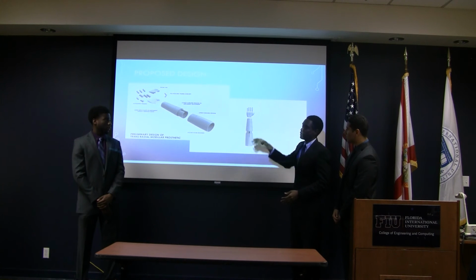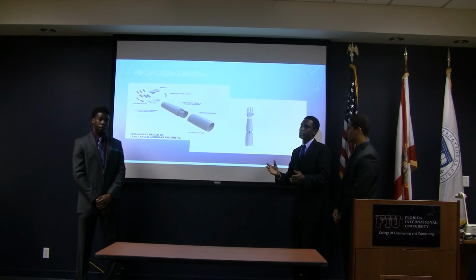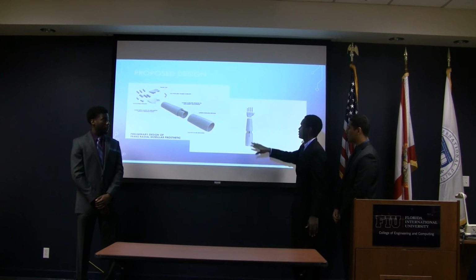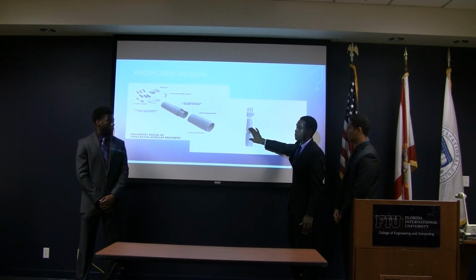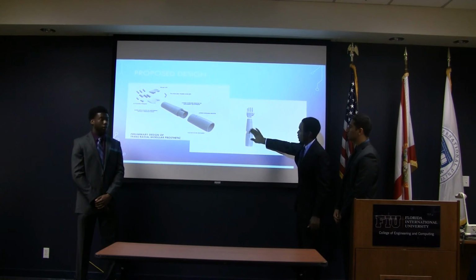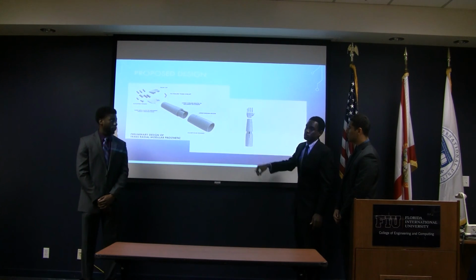The hand, we've got the anthropometric data, and we would say that, okay, between 5 and 8, we know the general size of children's hands. So we'll pretty much design it to be in the in-between area, and then keep the hand, but this part will be able to adjust for that age range of 5 to 8. So it'll have a mechanism in here to adjust accordingly.